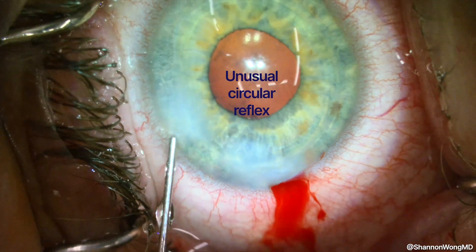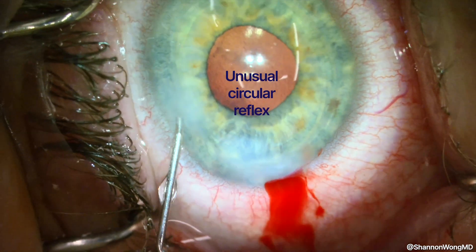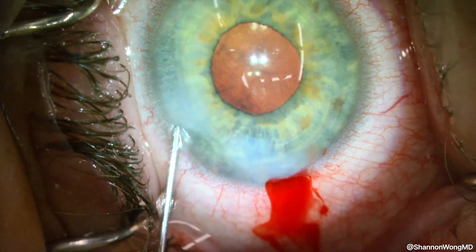I'm not sure, so I tell the staff, can you not discharge this patient right away? Let's take him down to the clinic and take a look at him. I look at him through the slit lamp microscope, and he has corneal edema. I can see there's something behind the anterior surface of his cornea, and I think this may be a Descemet's detachment.